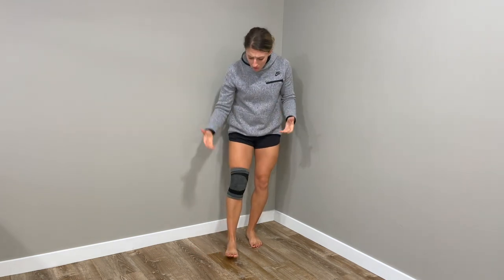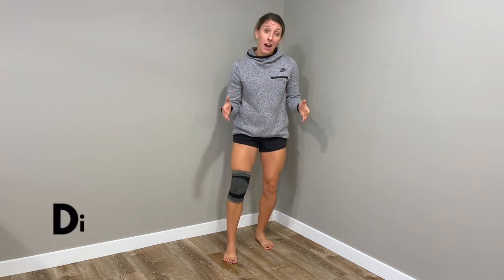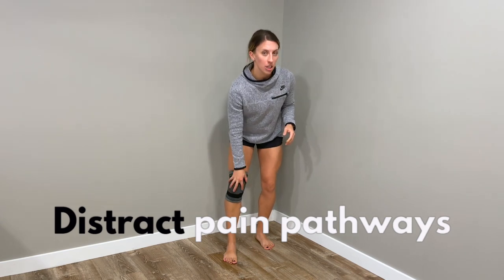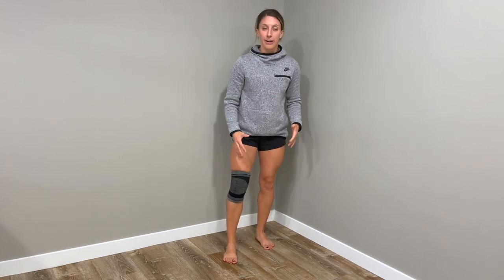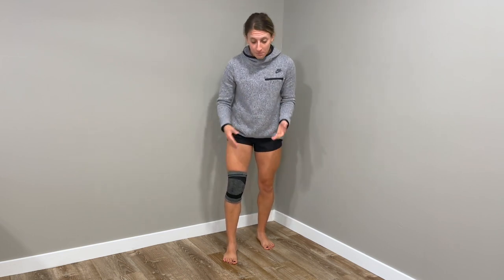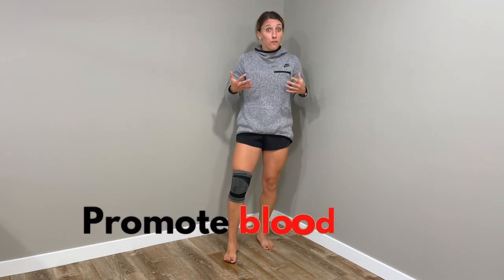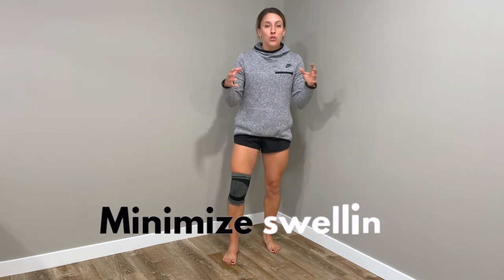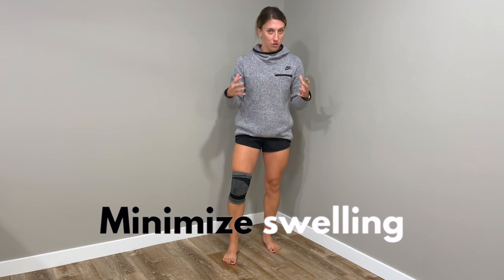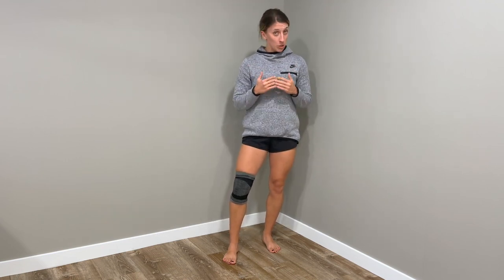There are many different theories as to how these compression sleeves work. Some say that the constant compression can distract some of the pain pathways your skin is sensing, thus reducing pain. If you're experiencing pain in a certain area and you apply pressure to it, a lot of times it can at least make it feel better temporarily.